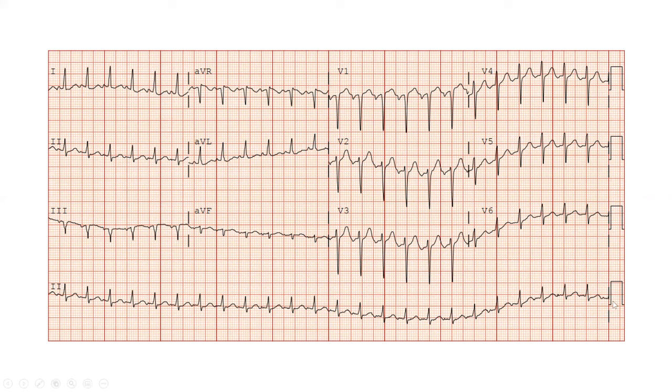Okay. Anybody else wants to talk about it? Small point, look at the very far end. There is a calibration. I tell my fellows about this conference in the morning, that the participants from Nepal are very particular about the speed check and also the calibration. You can look at the end of the EKG, there is a calibration. When you are looking at all the leads, at the very far end, look at the calibration. Sometimes the EKG tech can speed up to 50 millimeters per second, and then it will look like a wide QRS. So calibration is important. Thank you so much.